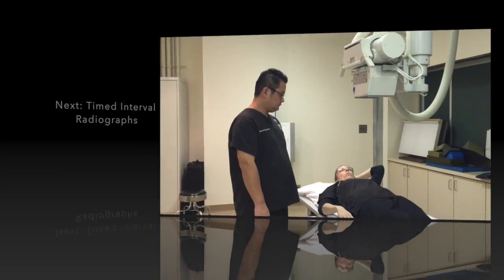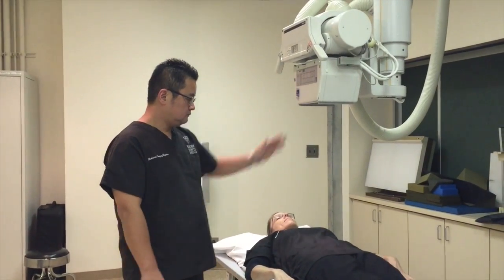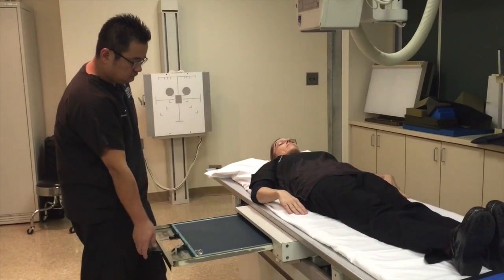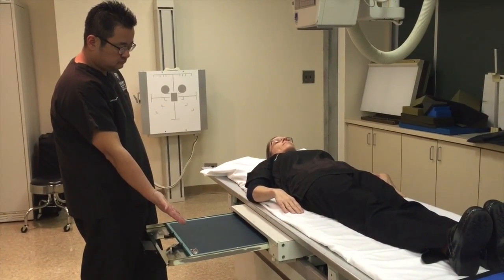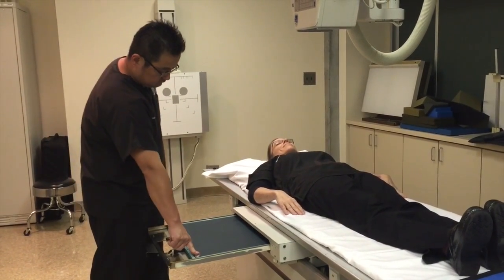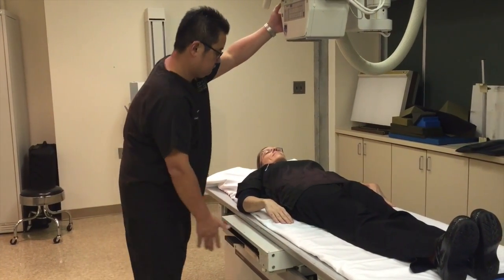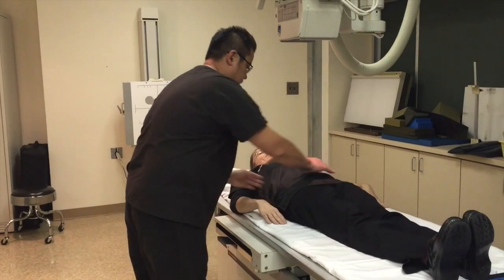Next, the technologist will perform a five-minute KUB. He will use a 14 by 17 inch IR lengthwise with the right marker in the bottom corner. The central ray will be centered at the level of the iliac crest and mid-sagittal plane.